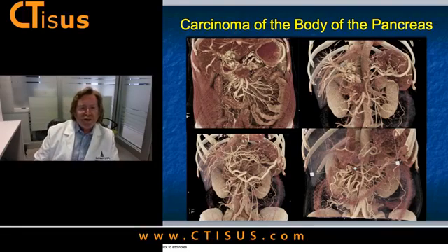So with that, let me speak to you a little bit about cinematic rendering. We put a lot of effort into 3D in general. We helped develop, with Derek Nye, the Pixar team, Silicon Graphics, and Siemens, all of the 3D volume rendering that you've known and come to love.